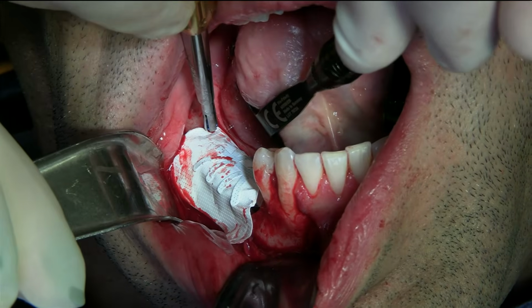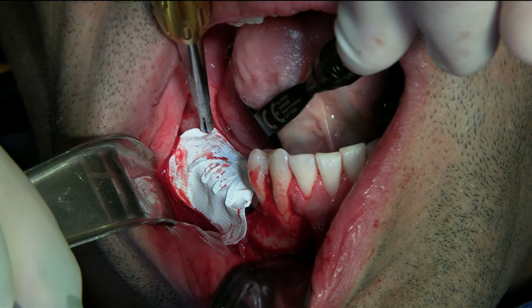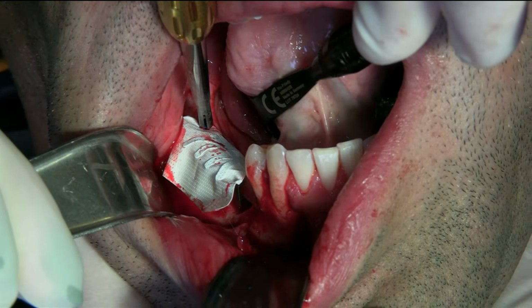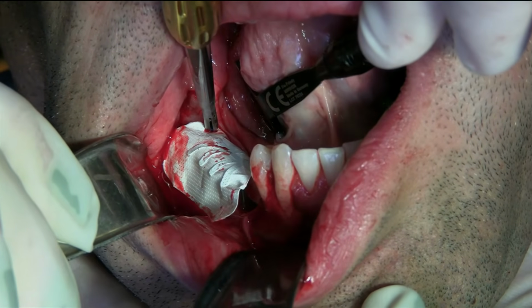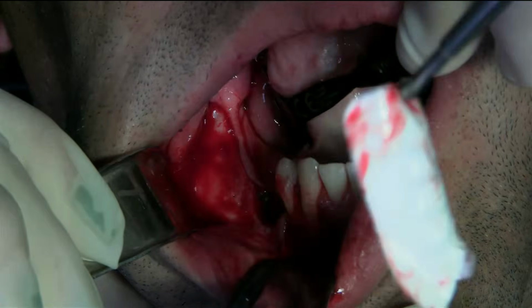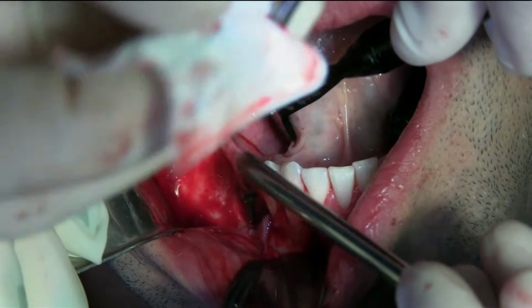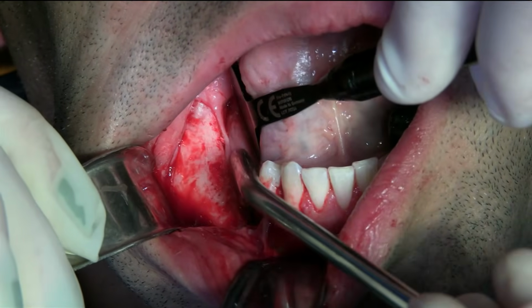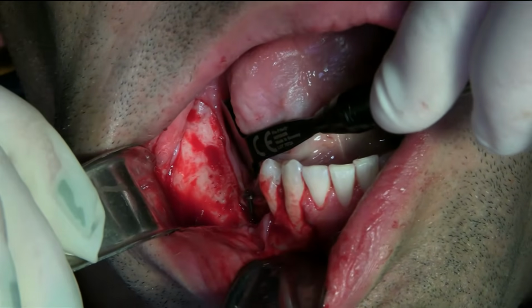That's good. So now, there's going to be a little bit tapping on your lower jaw. Hold this lower jaw. Yeah. Okay. Tongue, hold your tongue still. Just tapping. That's fine. Are you in pain? It's just a little bit. Discomfort?